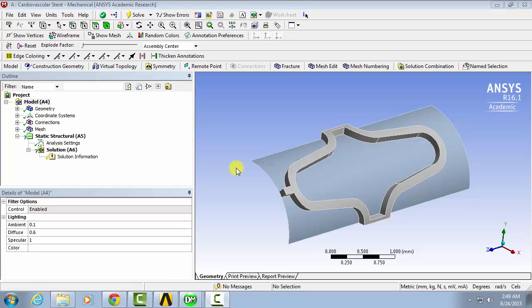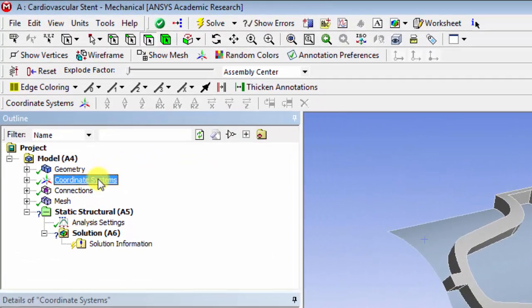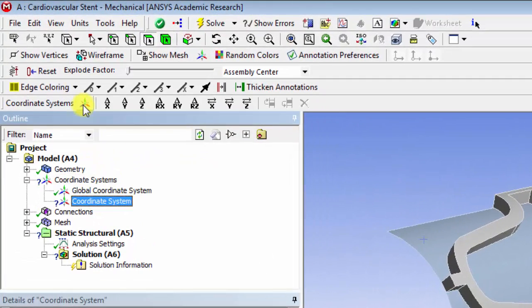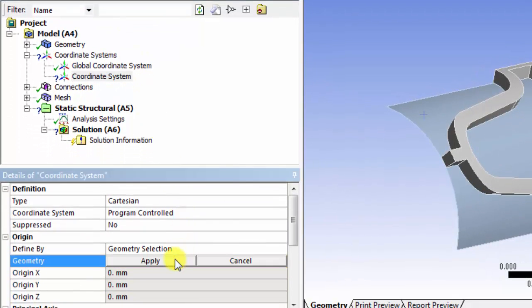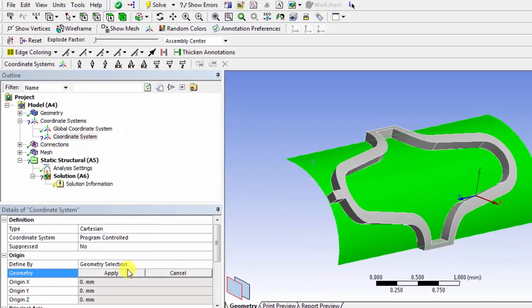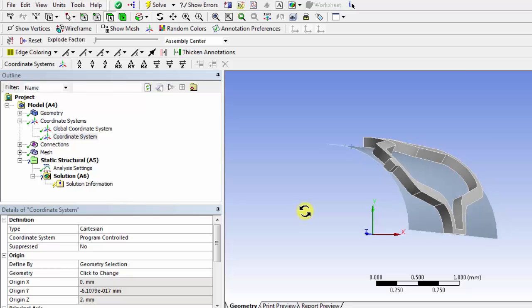Now we'll define the boundary conditions of the problem. First of all, it's going to be convenient to define a new polar coordinate system since our displacements are going to be defined radially from the center of the balloon. To do that, we'll select coordinate systems and then click on Create Coordinate System. From here, we can click on the geometry and select the balloon and hit Apply, and it'll automatically create a coordinate system at the center of that geometry.